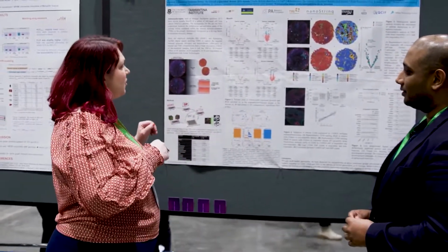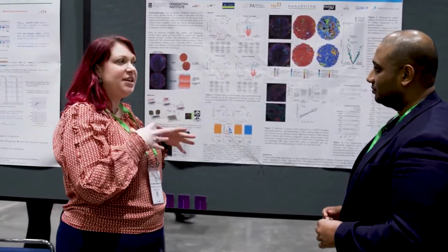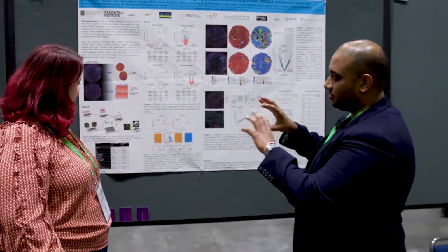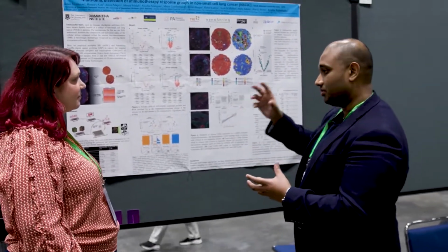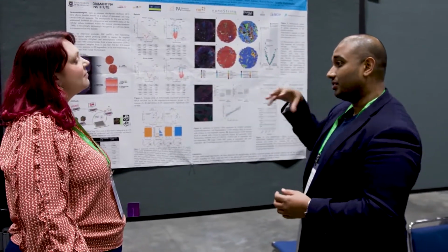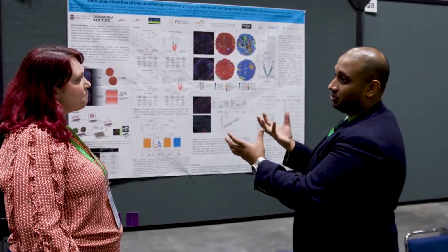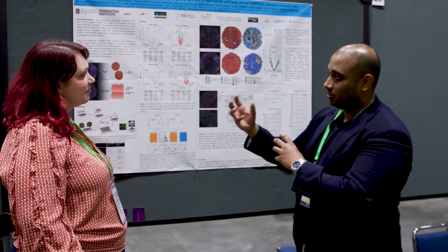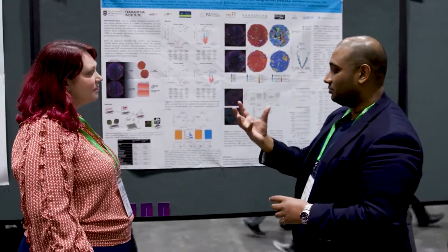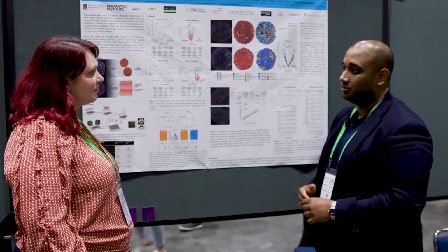So what was your selection strategy for profiling different regions, and did you segment within each region? Yeah, great question. Because it was a tissue microarray, we used tumor and stroma. The way we did that was we gated on cytokeratin and non-cytokeratin. When you do that, you effectively capture the tumor and the stroma from every TMA core. So that's what you can see here. We used cytokeratin to capture the tumor regions and CD45 and non-cytokeratin to capture the stroma.